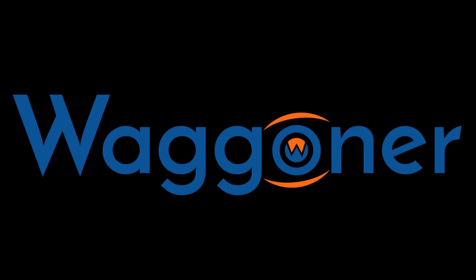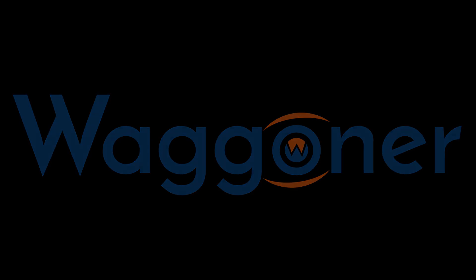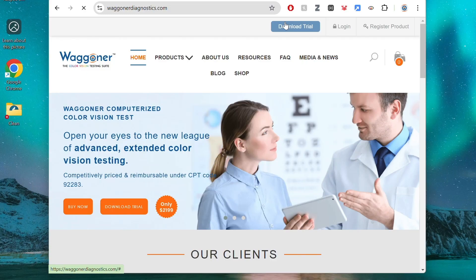In this video, we will walk through the process of downloading and registering the Wagoner Color Vision Suite, including the FAA exam, on a Windows device. First, use your internet browser to go to WagonerDiagnostics.com, then click Download Trial at the top of the screen.